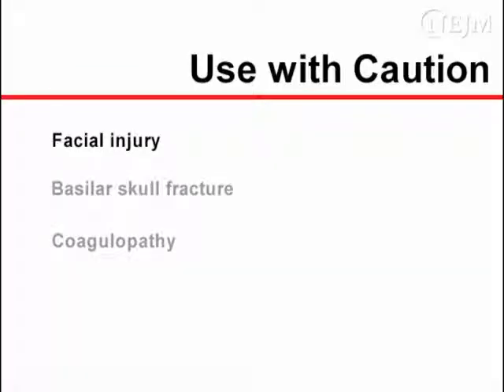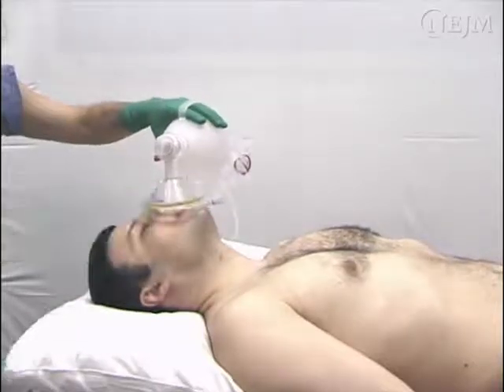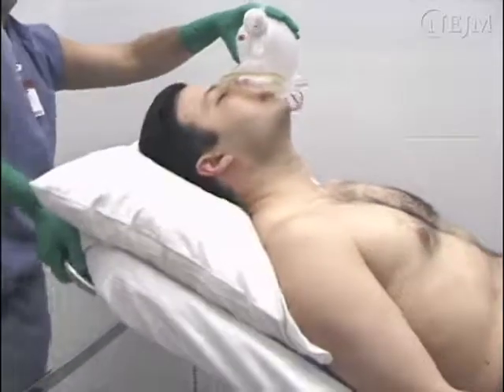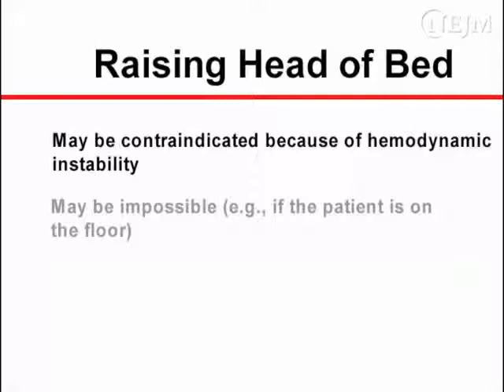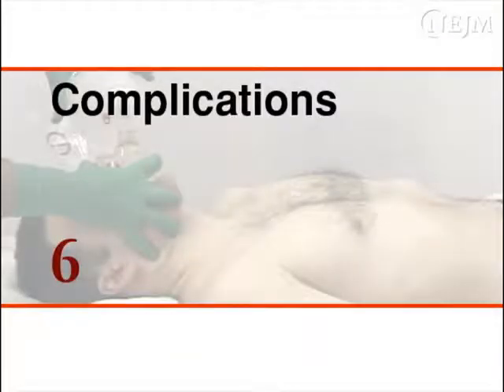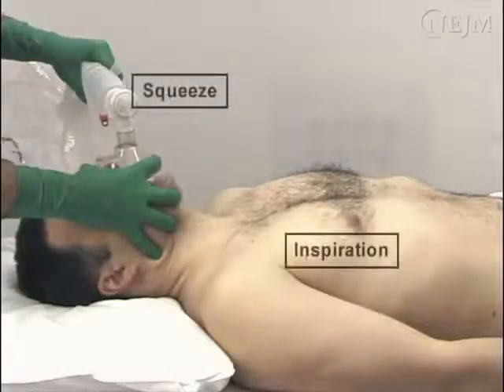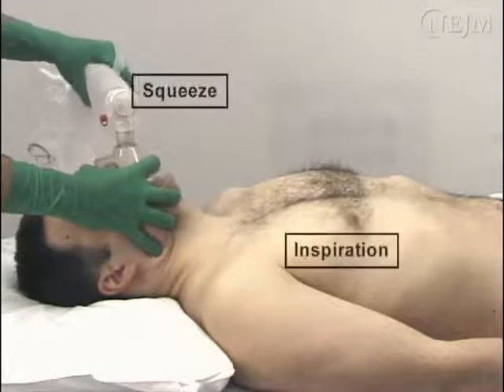They must be used with extreme caution in patients with facial injuries, basilar skull fractures, and coagulopathy, weighing the risk of further injury and bleeding against the need for oxygenation. Raising the head of a bed may facilitate the delivery of adequate tidal volumes, but may be contraindicated because of hemodynamic instability or may be impossible, for example, if the patient is on the floor. When the patient is breathing spontaneously, one must synchronize the delivered tidal volume with the patient's inspiration.